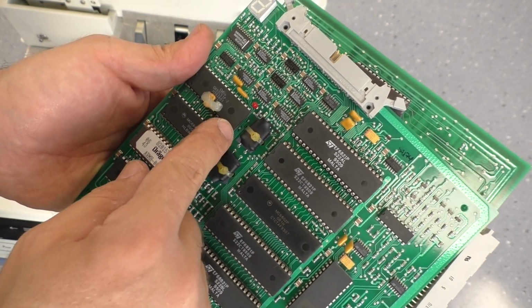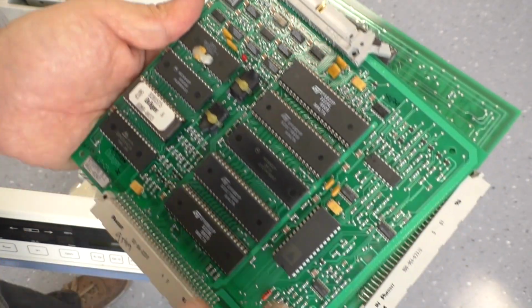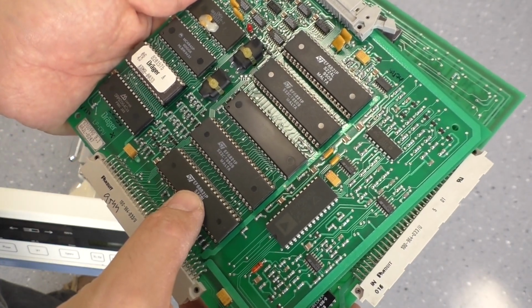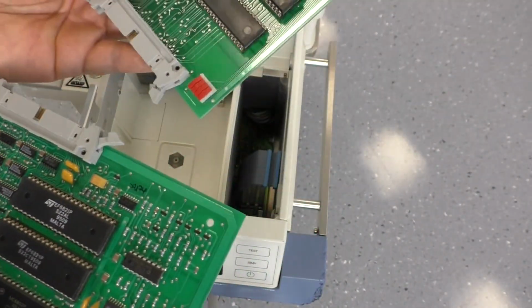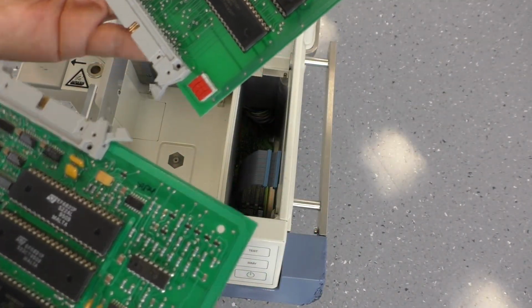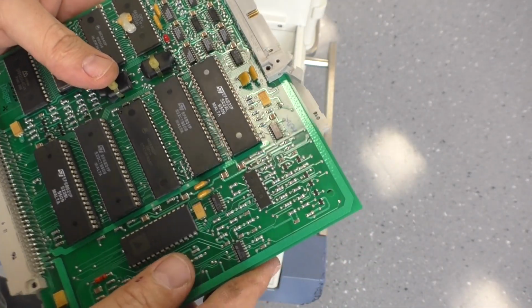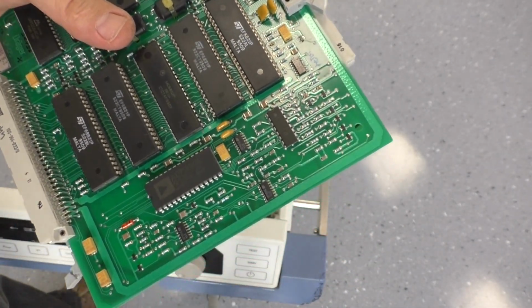That could be a RAM, is it? No, have to look at it. 68B21. Yes, it's the same. So I think that's a lot of digital I/O port stuff.